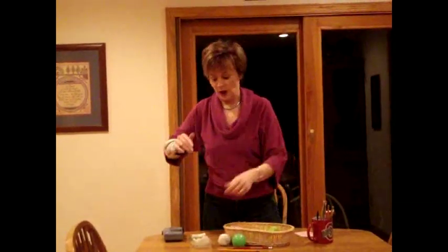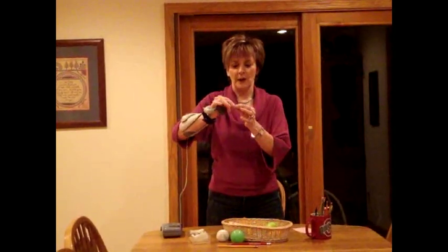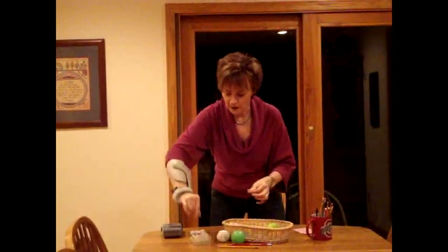I wanted to do some different objects, so I found out in my garage, my husband had a lot of little nuts and bolts and screws, so I got some smaller, all different size objects, and I would pick that up, and I'd lay it over there.